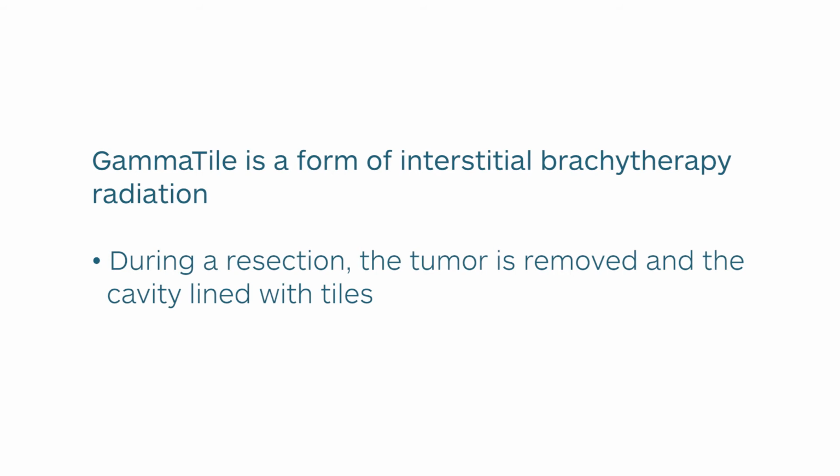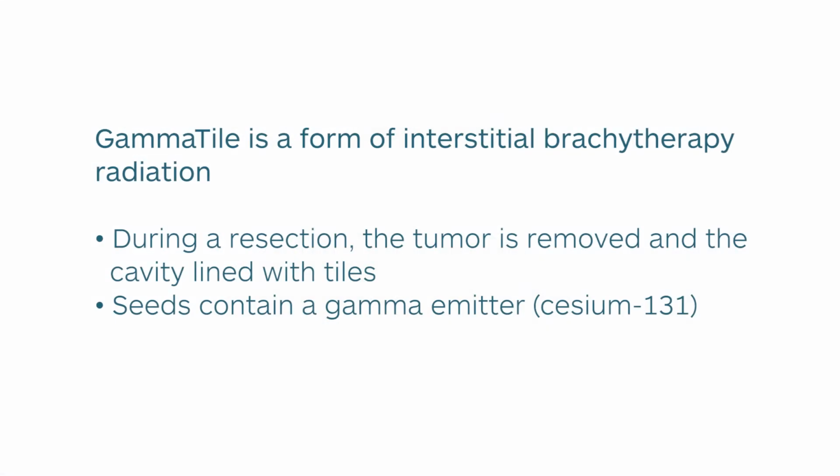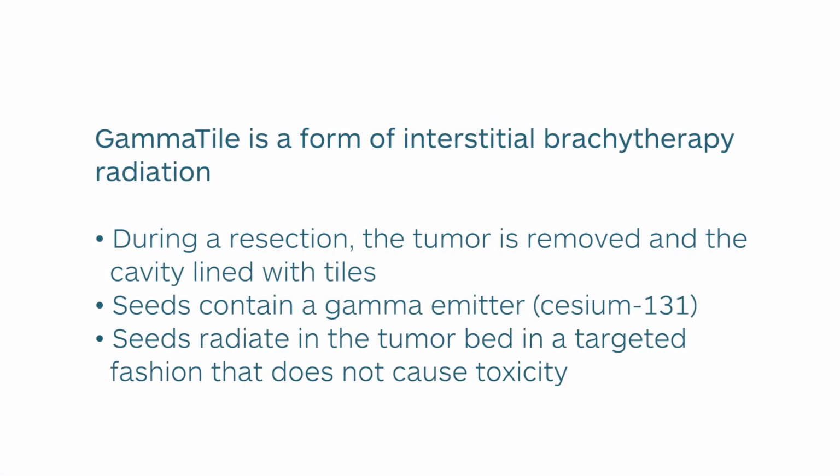Now, these tiles are composed of a collagen matrix with embedded seeds, and the seeds contain cesium-131, which is a gamma emitter. So once the tiles are in place, the surgery is terminated, and the seeds will continue to shed radiation into the tumor bed as the patient continues to heal from the surgery.